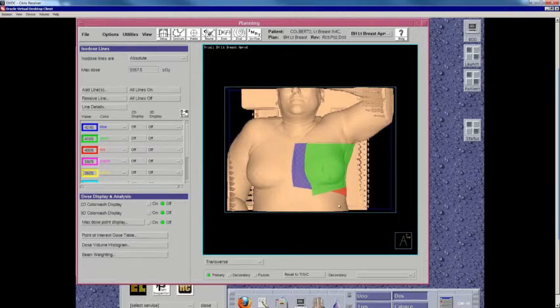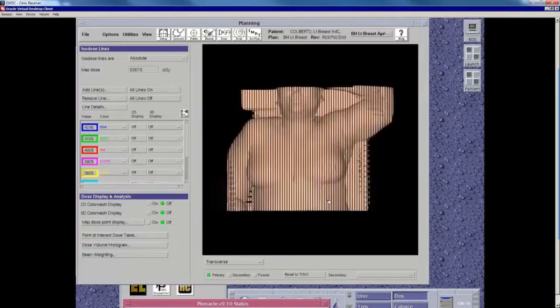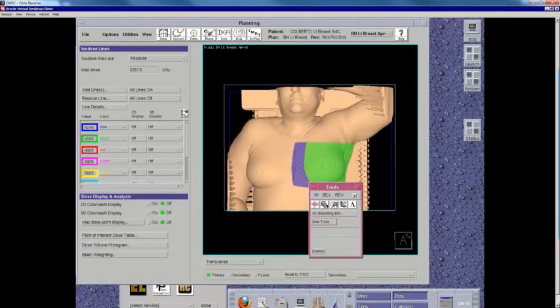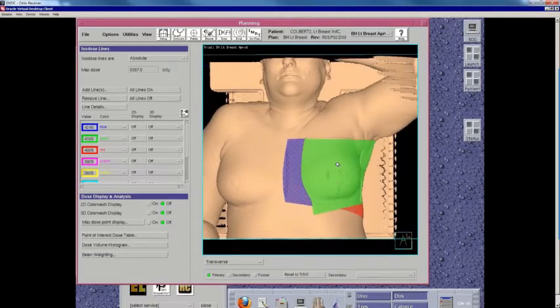Before I scan a patient, there are a gazillion right ways to mark a patient. For this particular patient, she had had a segmental mastectomy and a reduction mastopexy, an oncoplastic surgery, if you will. So I marked her surgical scars, which you can see here. I marked 12, 3, 6, and 9 o'clock around the areola, marked this vertical mastopexy incision, and then hers went off in that direction.